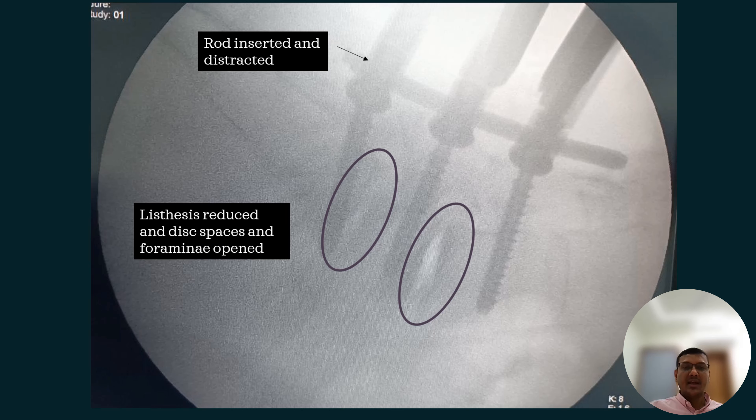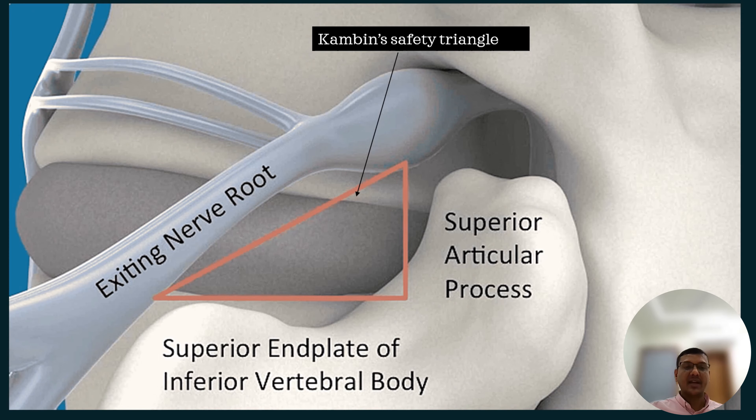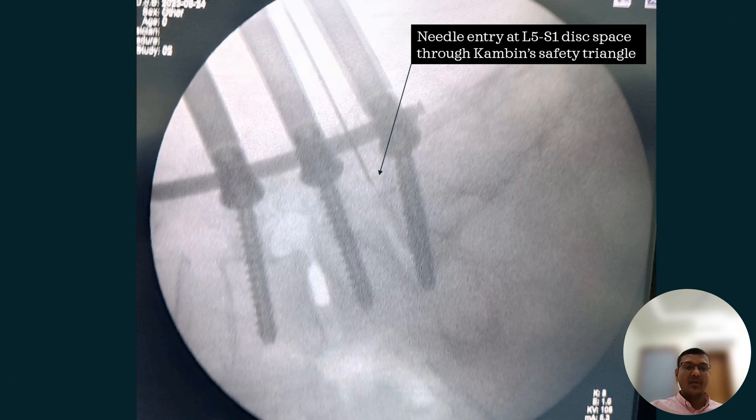Then we move to the opposite side and do the disc preparation and cage insertion through Kambin's safety triangle. During this maneuver we can injure the exiting nerve root, and that's why I prefer the patient to be awake under epidural analgesia rather than general anesthesia.